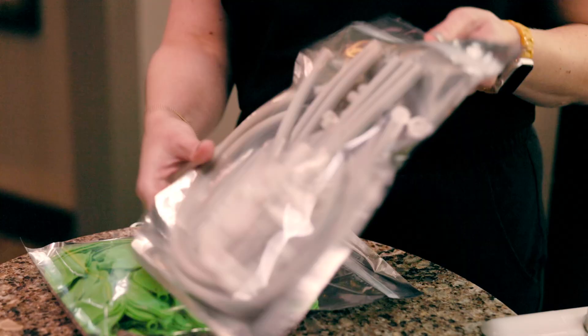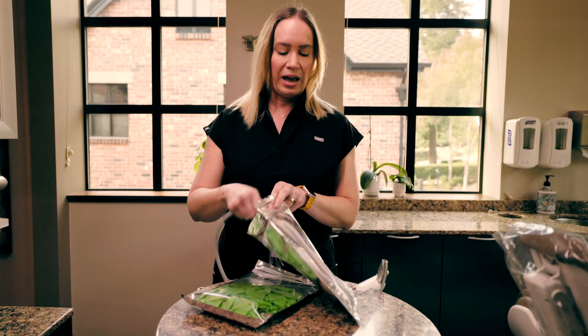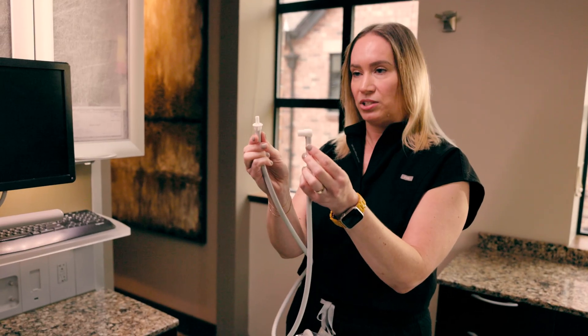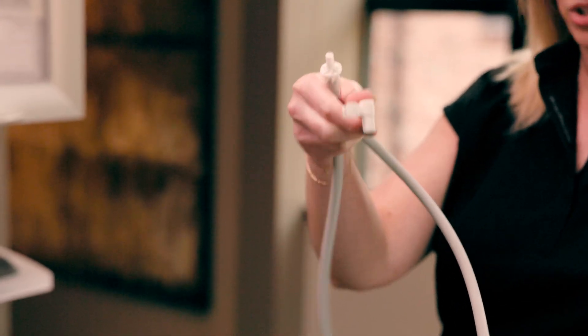Here I have the package with the tubing. I'm going to open this first. It comes with the long connector tubes and the shorter ones. I'm going to take out one of the longer ones. You've got two connections here — this connection right here is going to go straight into your high volume evacuation unit.